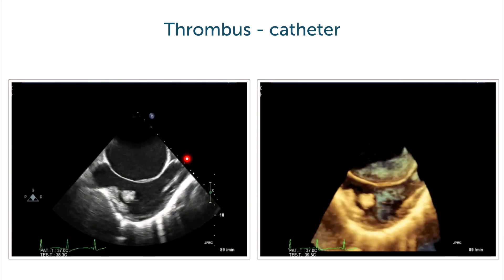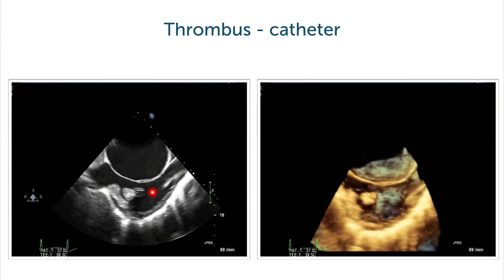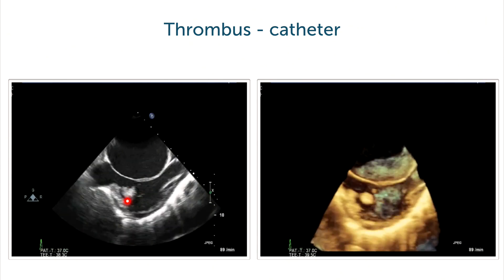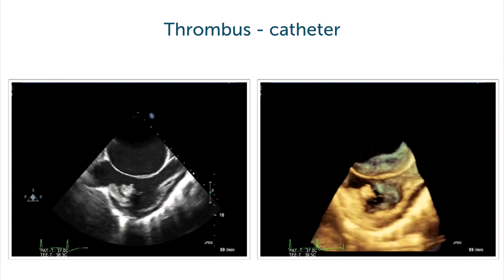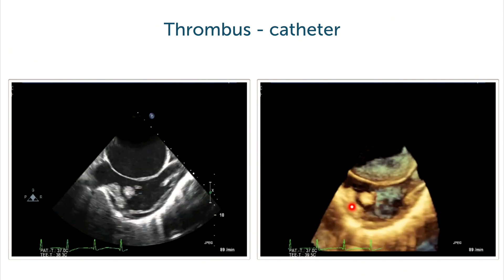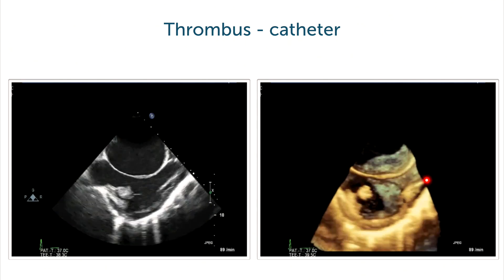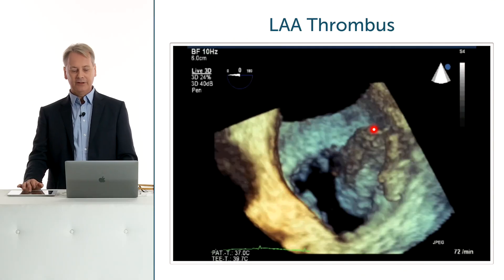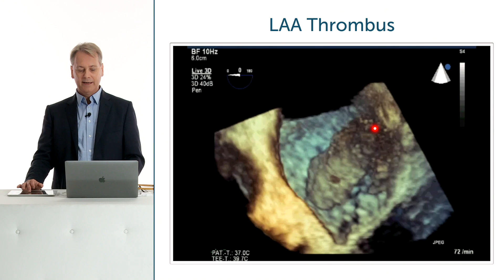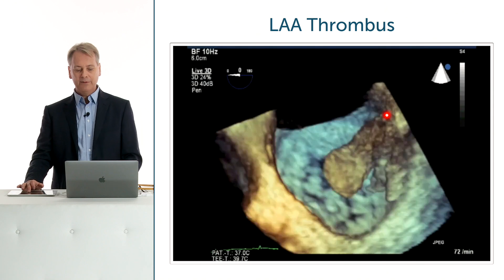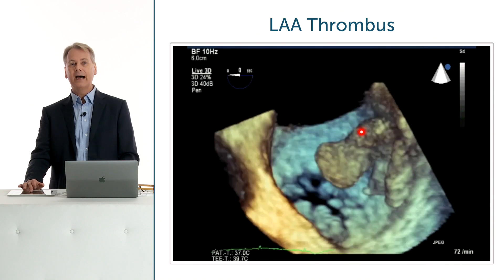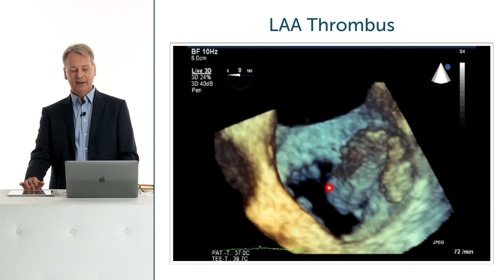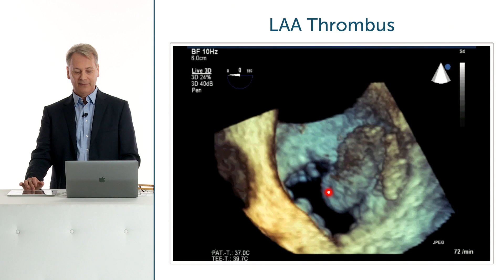A patient with a central line, a vegetation right here, again seen in 3D. And finally a patient who had a thrombus peeking out of the left atrial appendage, right towards the mitral valve.